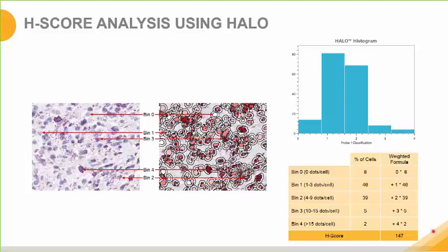Clusters are divided by the typical probe signal area, calculated as the dot number for the clusters. So in other words, the size of that cluster is determined by the software, and then based on that size, an average number of single mRNA molecules is determined through the software algorithm. An H-score calculation can then be performed on the entire tissue, the entire region of interest, to assign a single score to a selected area based on the average target expression in this tissue. In this case, the H-score for the given biomarker was 147 out of a possible 400.